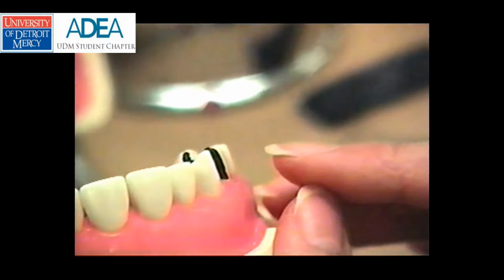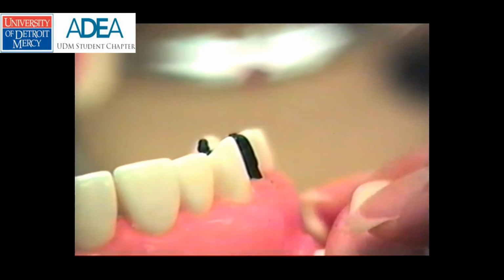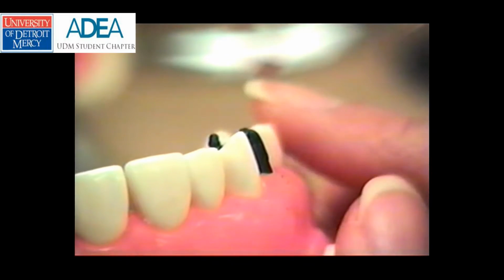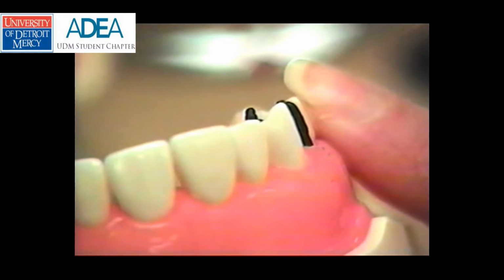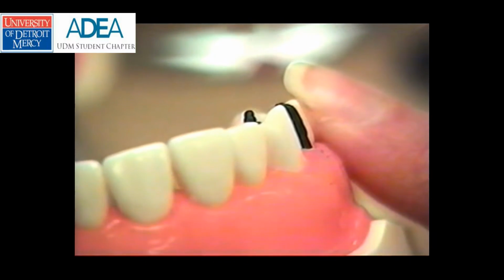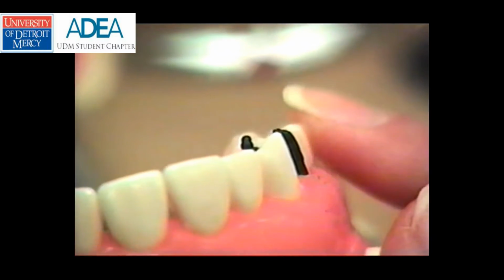So now we've got a reasonable idea of where our facial contour is going to be. Not perfect yet, but it's close to where you need it to be. You can see that it's very close to parallel with the premolar and the canine. The cusp tip is close to where we need it to be.